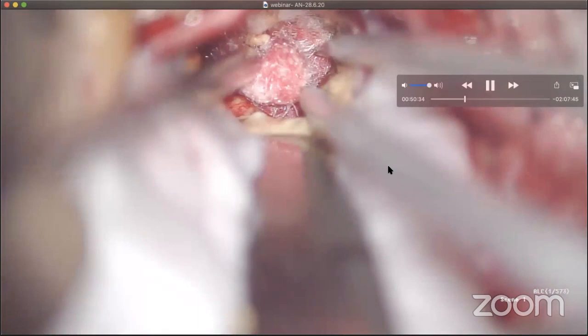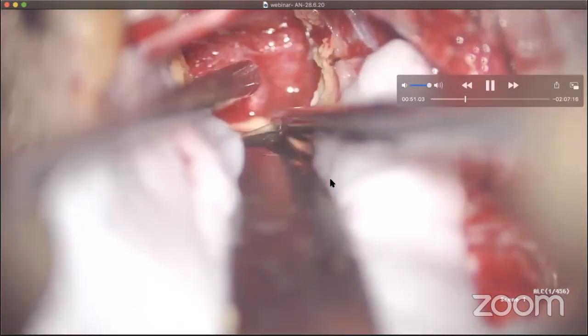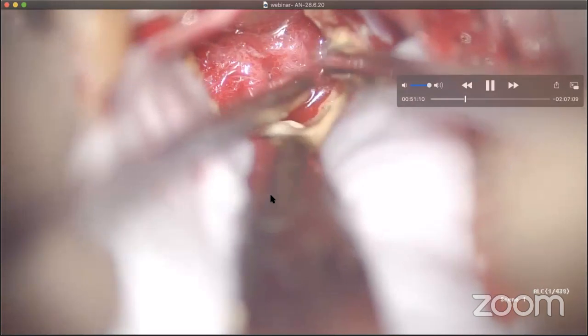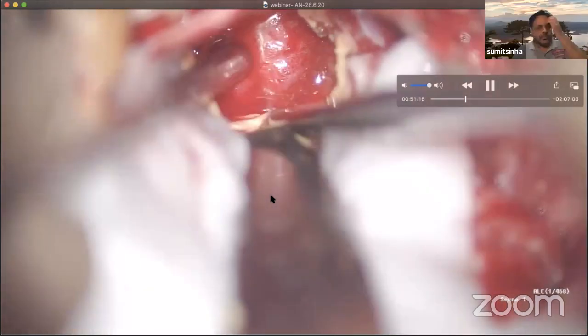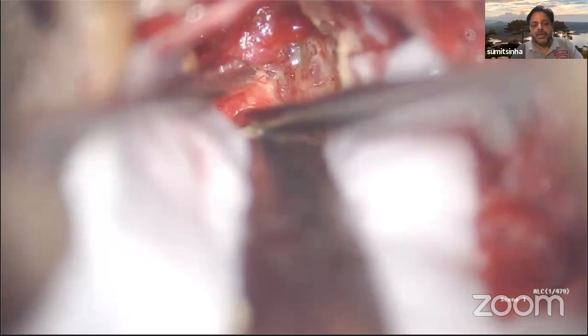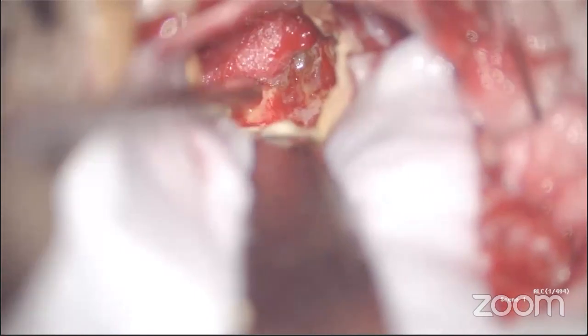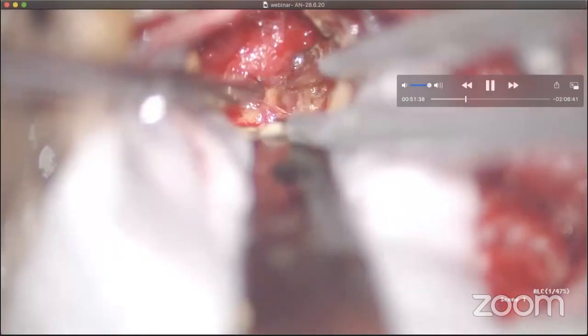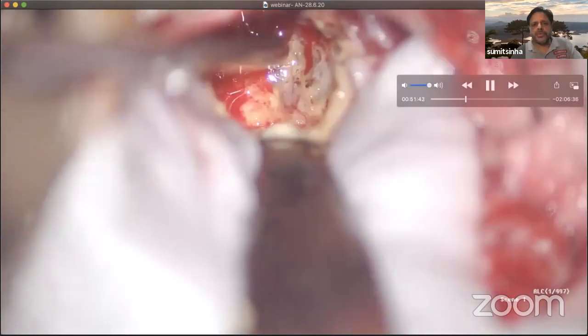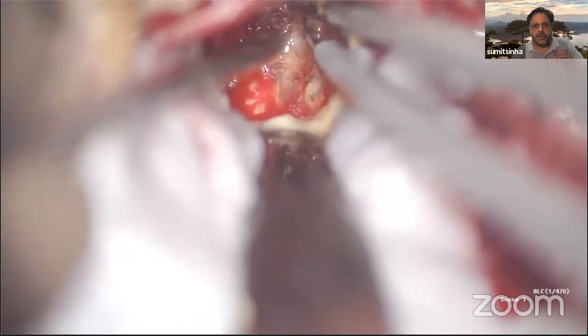Okay. Anand asks, sir, when during dissection do you identify the meatal part? I think he wants to ask at what point of time I drill the meatus. Yes, the meatal part. I generally don't bother about the meatal part till I have removed at least 70-75% of the tumor.